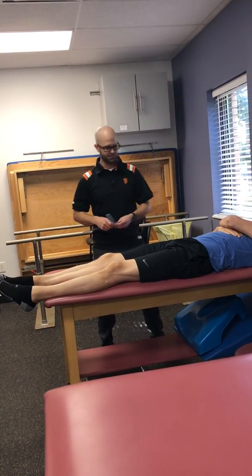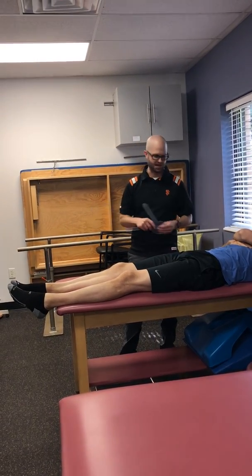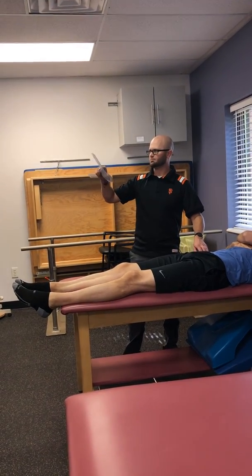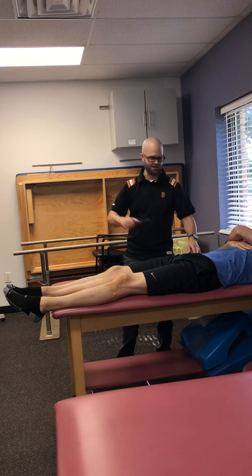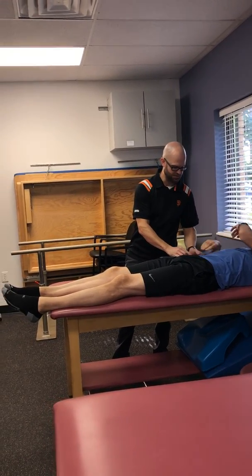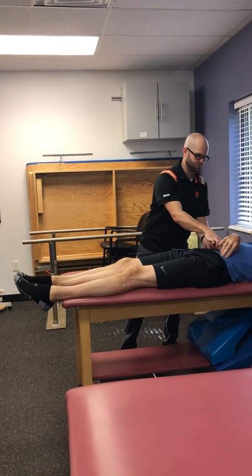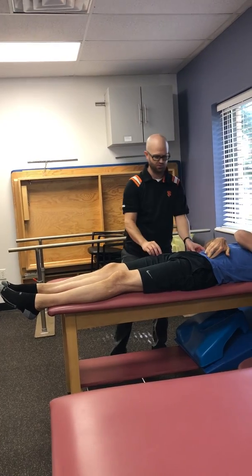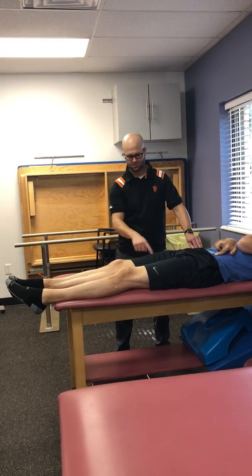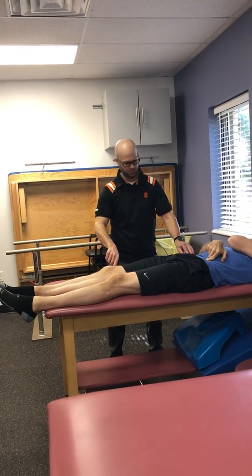My alignment points. What do you think I want my fulcrum to be aligned with? The ASIS, okay? What about my proximal arm? The other ASIS. So I can actually have the patient help me out with this. There's one ASIS. If you can find your other one there, good. And then I just want you to hold this arm right there, perfect. And then my distal arm is going to be lined up down mid-shaft of the femur, essentially mid-patella. That's what I'm lining up with, okay?